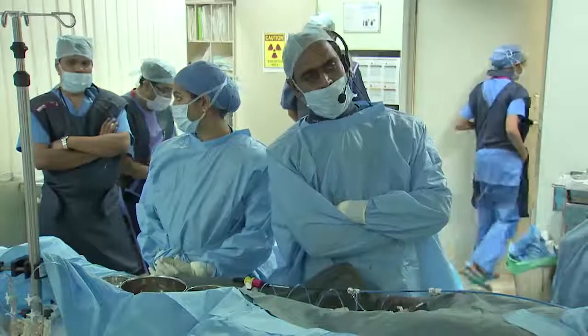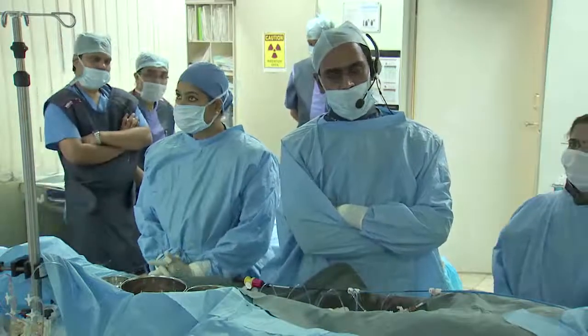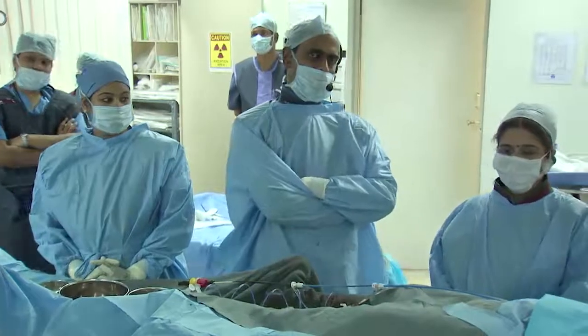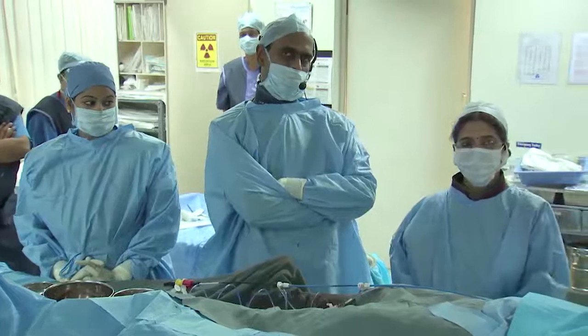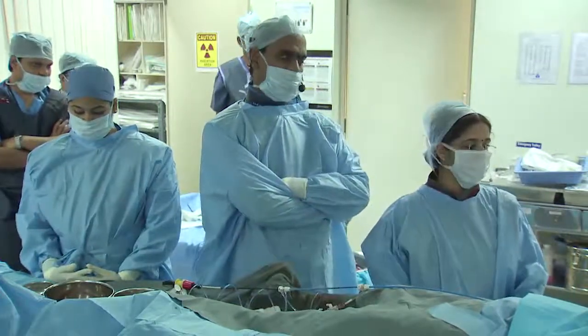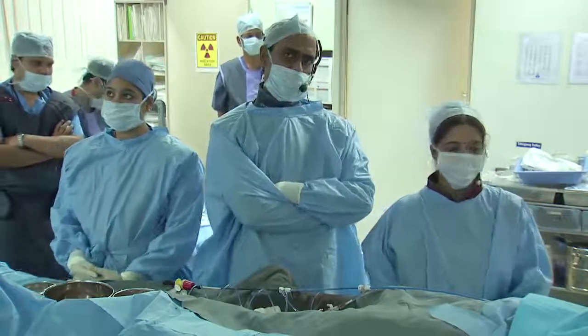He's, as it was pointed out to you earlier, already on 2 pulmonary vasodilators, sildenafil and bosentan, and warfarin. So I don't want to make it too small, a fenestration.